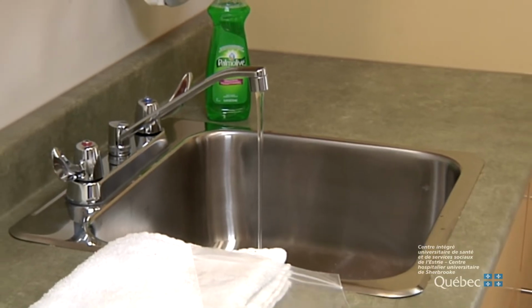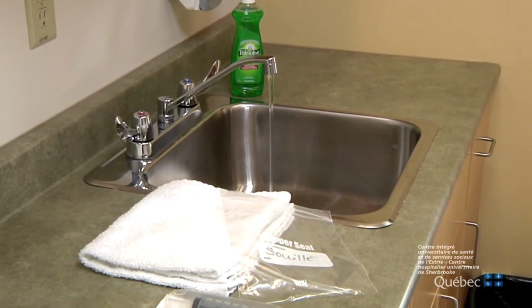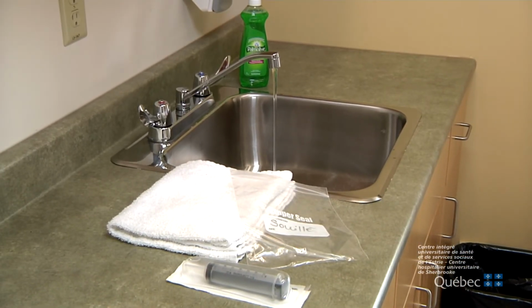The catheter must be cleaned after each use. You'll need the following items to clean your catheter: tap water, a hand towel or paper towel, the plastic bag marked soiled, and a syringe with a catheter tip. These are the steps to follow in cleaning your catheter.